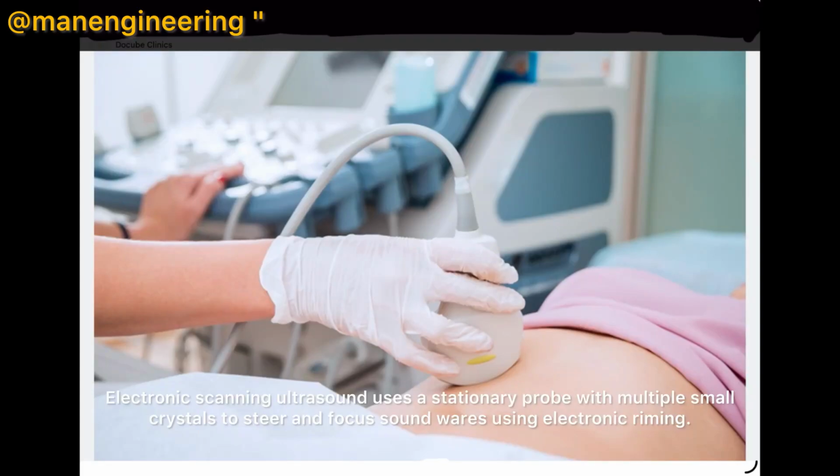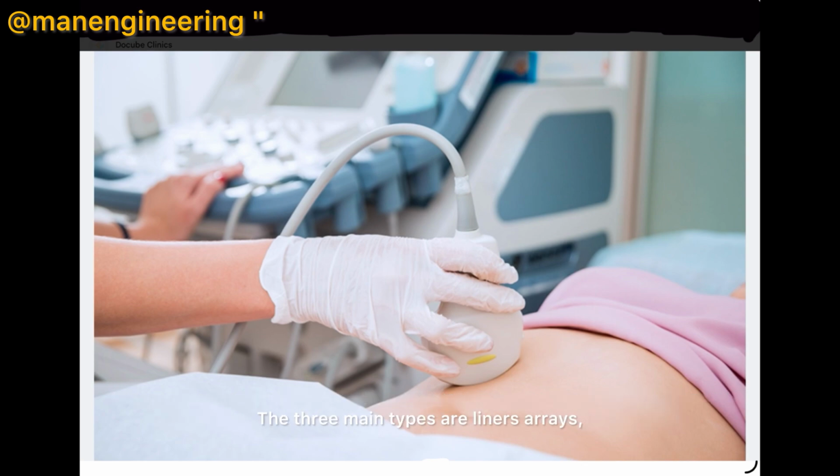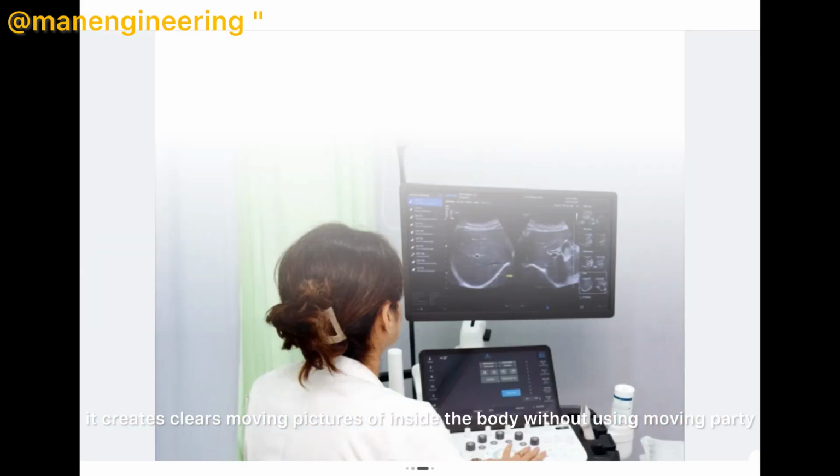Electronic scanning ultrasound uses a stationary probe with multiple small crystals to steer and focus sound waves using electronic timing. The three main types are linear arrays, curved arrays, and phased arrays. It creates clear, moving pictures of inside the body without using moving parts.